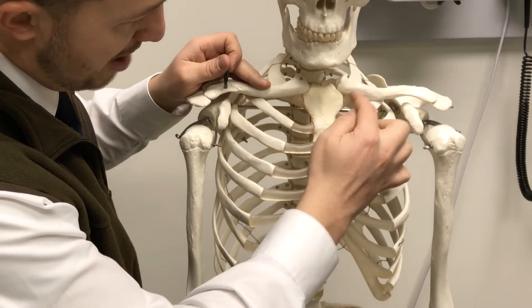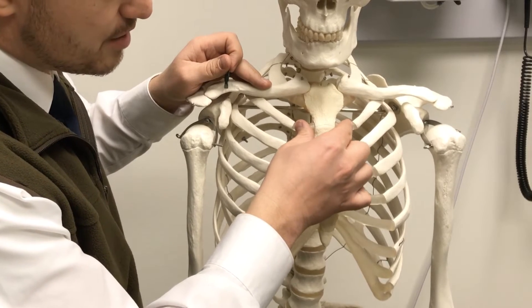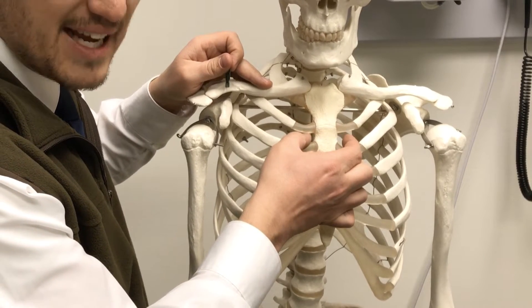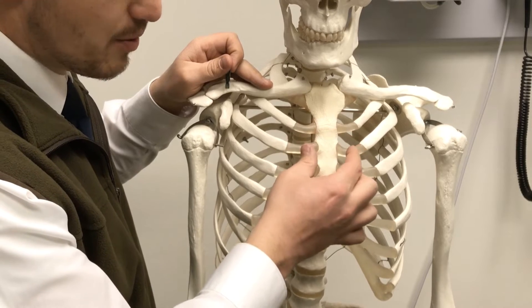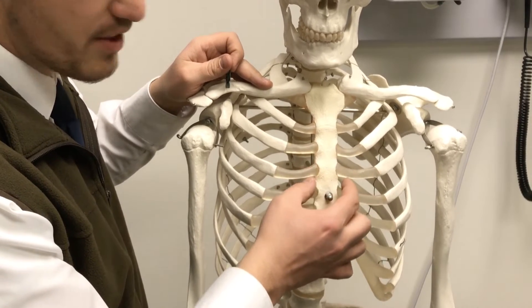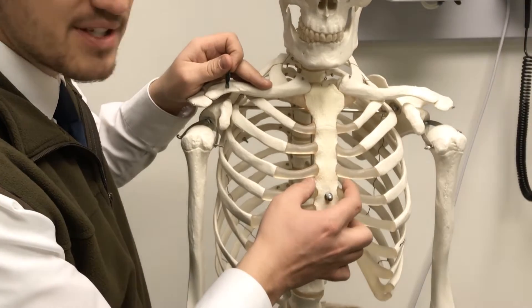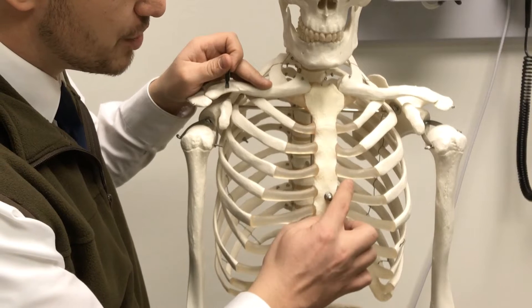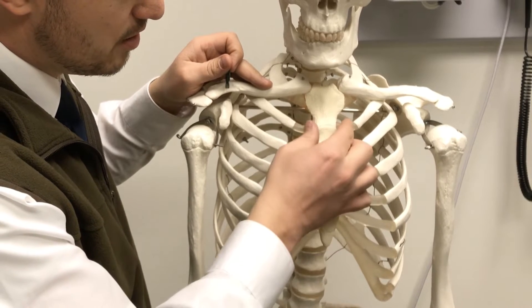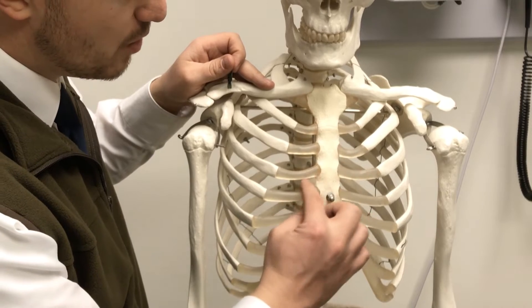The first rib is up high under the clavicles — this is rib number two. The inner space just below it is the second intercostal space. Then we've got the third rib, third intercostal space, fourth rib, fourth intercostal space. So this is what we're palpating for on our patient to decide where we're going to place V1 and V2: sternal angle, rib two, fourth intercostal space — V1, V2.